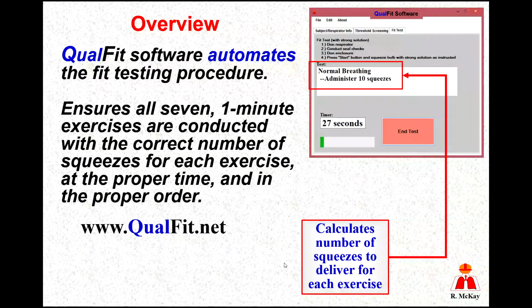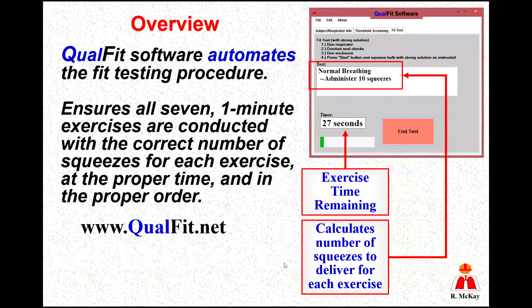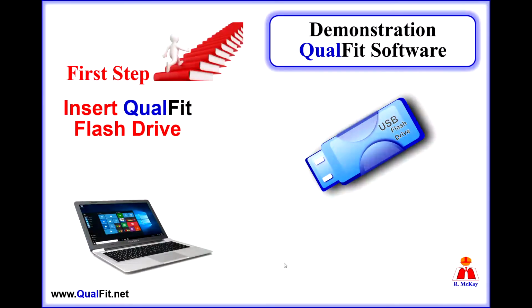Underneath the test window is what we call the timer. The timer will indicate how much time is remaining for the current exercise. So let's begin.